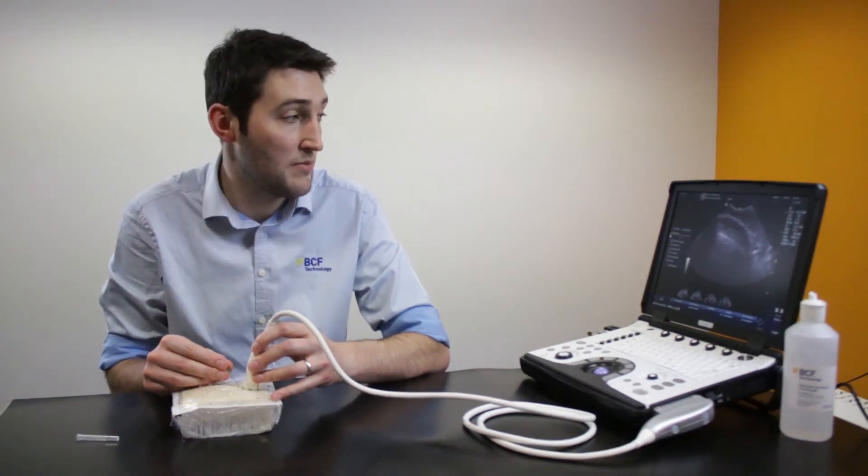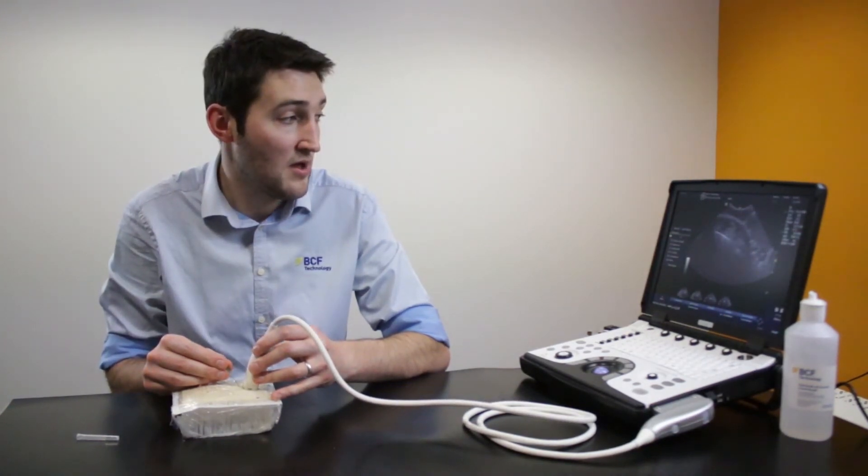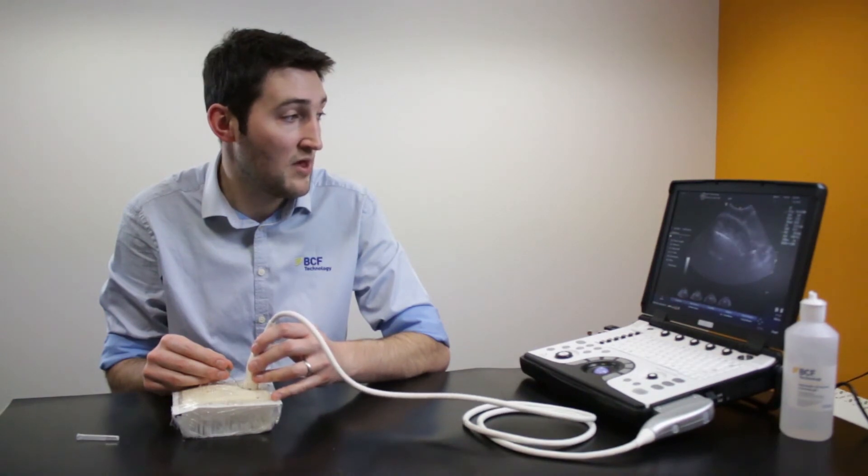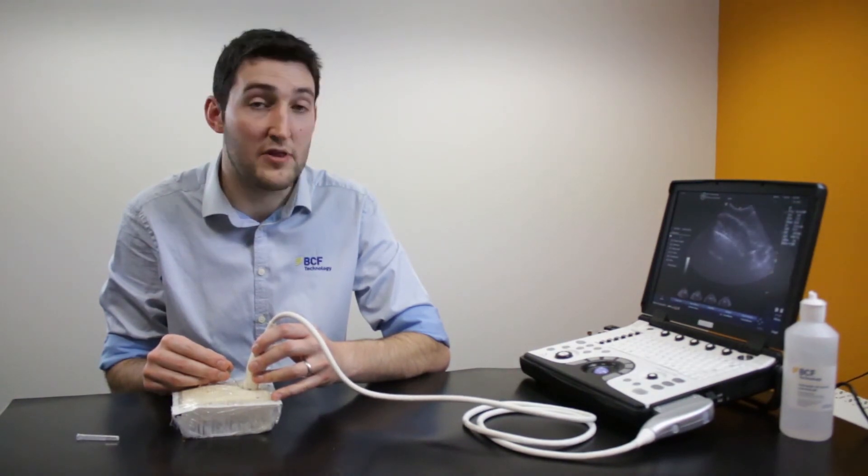In this instance, I'm going to basically rock my probe, fanning it backwards and forwards until I've picked the needle back up again there.